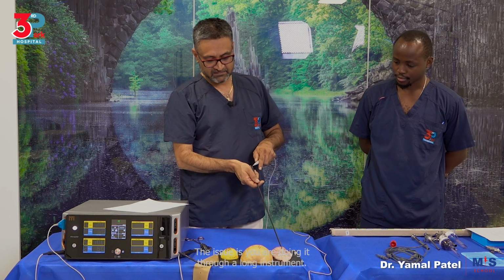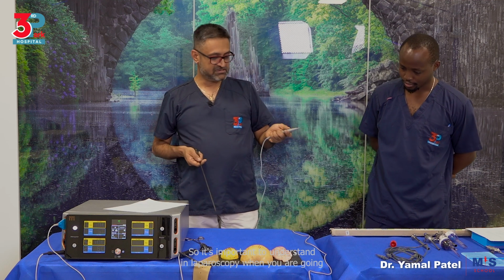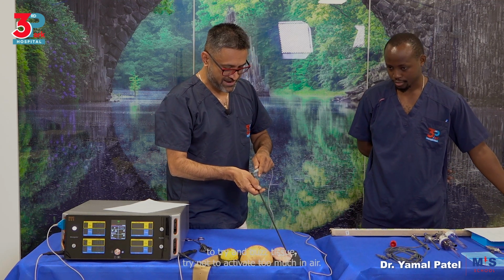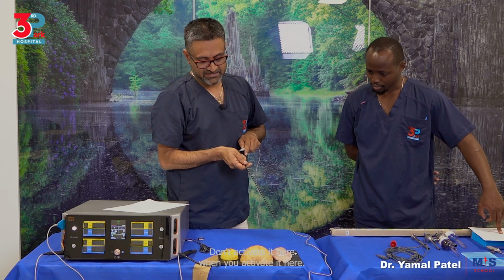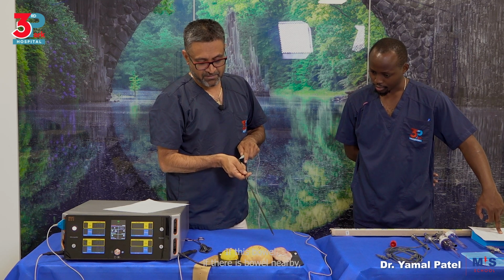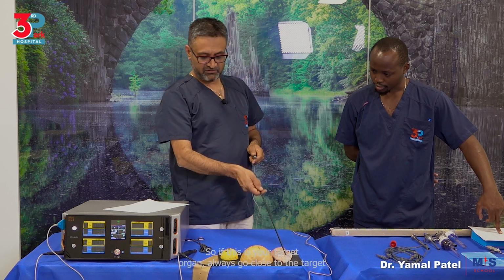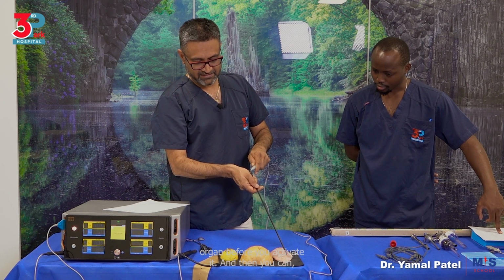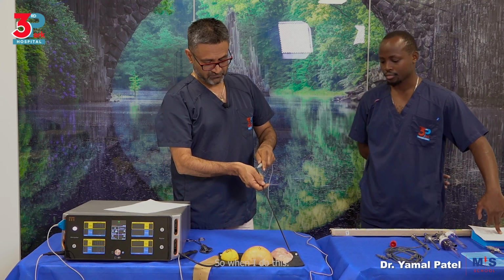The issue is you are doing it through a long instrument. So it's important to understand in laparoscopy, when you are going to try and buzz tissue, try not to activate too much in air. Don't activate it here. When you activate it here, if there's bowel nearby, the electricity will jump from here to the bowel nearby. So if this is your target organ, always go close to the target organ before you activate it, and then you will see it jump.